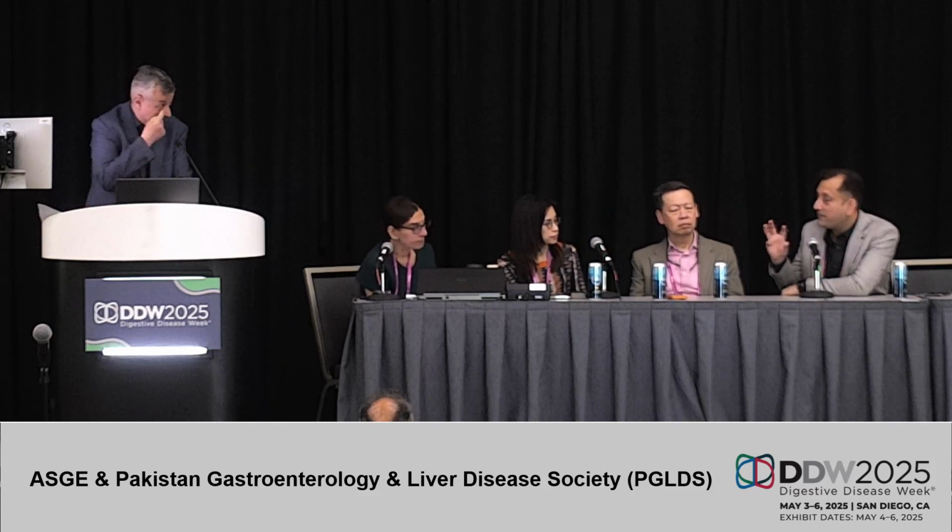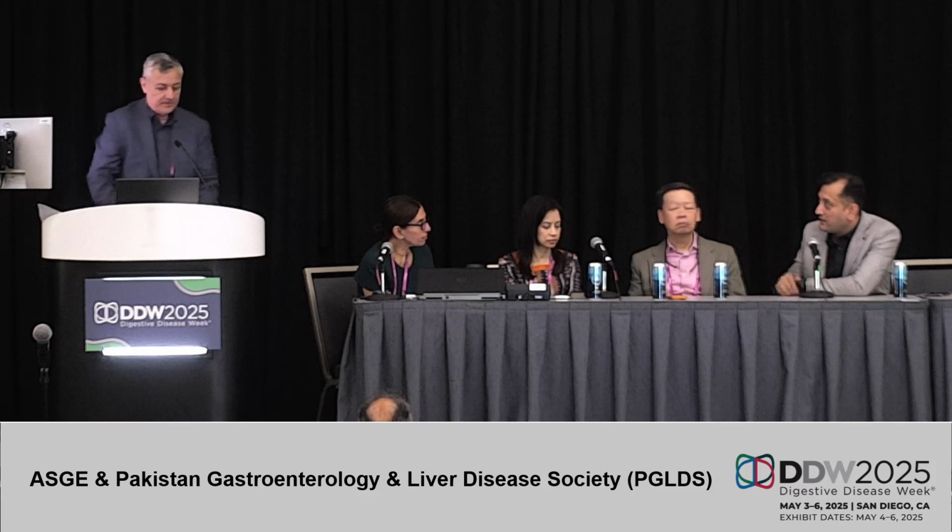Great talk, Prof, as always, and a great admirer of your presentation. My question is regarding pancreatic adenocarcinoma. They have a severe desmoplastic reaction. So, are there ways to predict sonographically on B mode or elastography or strain ratio so that we can avoid those areas? Because elastography only says benign or malignant, two spectrums, right? So, any tips to avoid those areas?